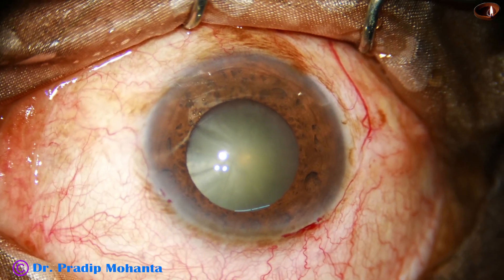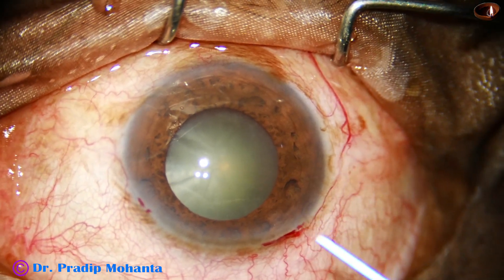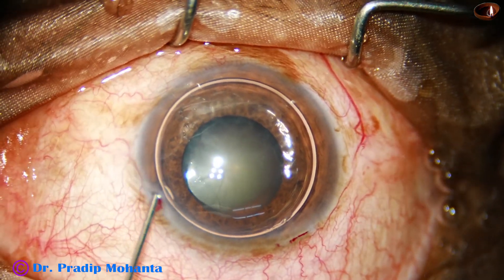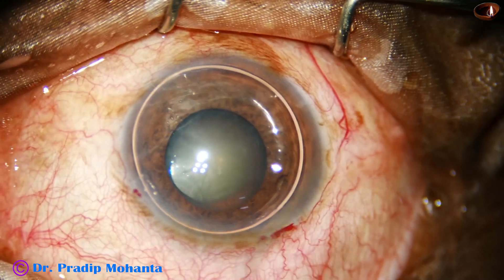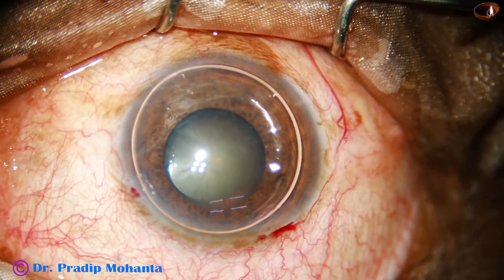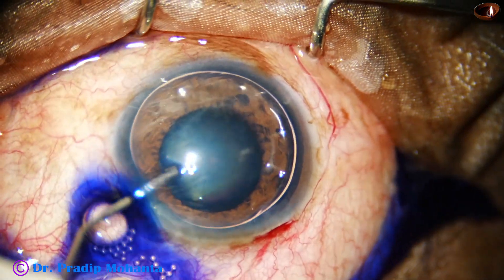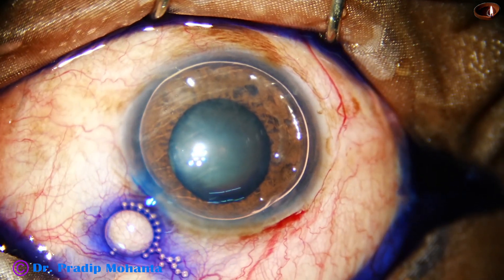The anterior capsule is stained with trypan blue dye. I use the dye underneath an air bubble. There are many colleagues who use the dye directly, but I find that if I use an air bubble, the dye is not diluted by aqueous and staining is quicker.